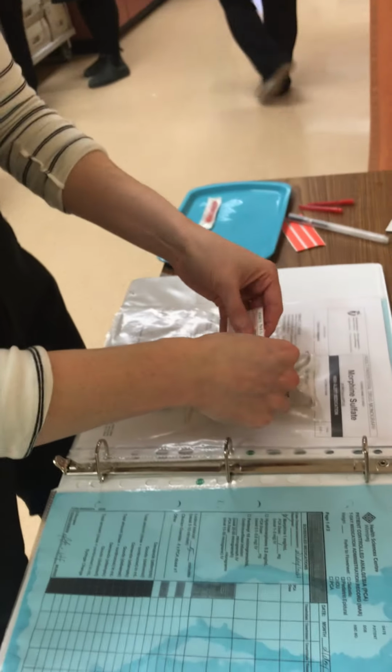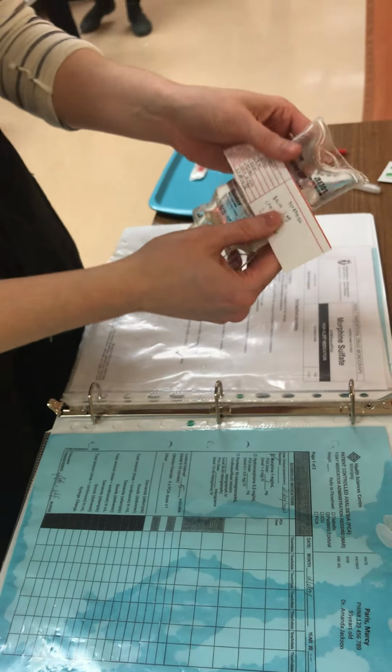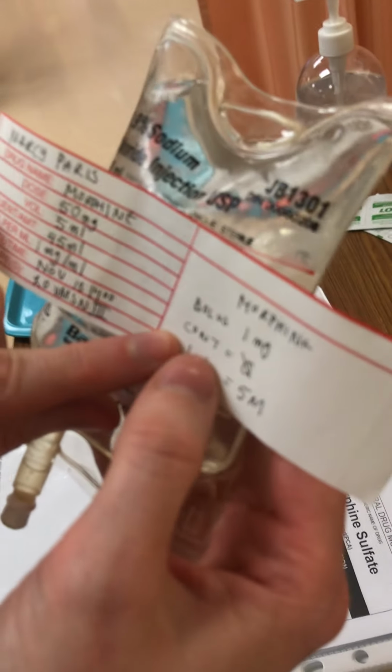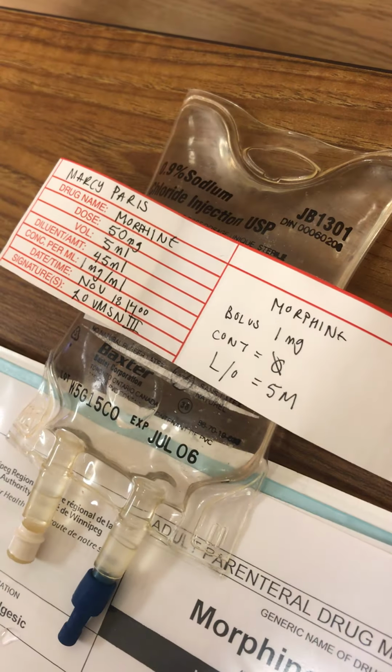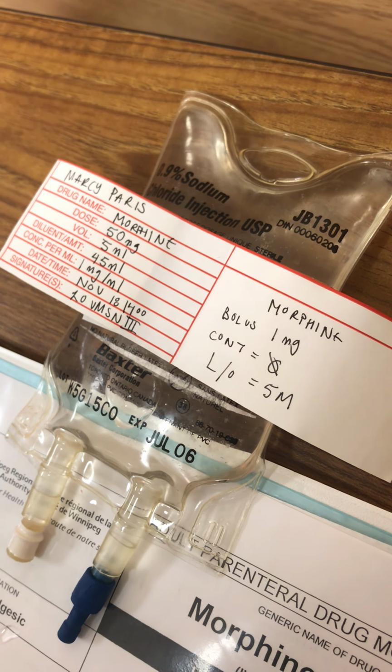Now I'd give this a nice shake so the medication is mixed up, and I would add my label. You'll notice the label has a bolus of 1 milligram. It's not a continuous, and it's got a lockout of 5 minutes. When I go into the room, the pump will reflect that. So going into the room, disposing all of these in sharps containers, all of the needles in sharps containers.